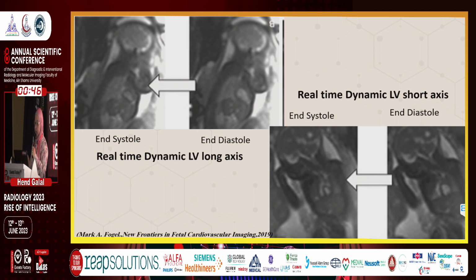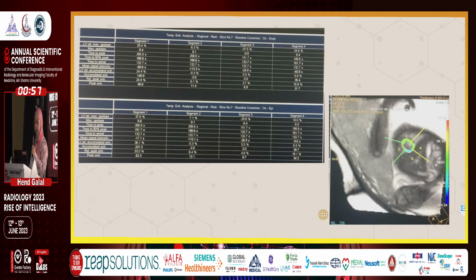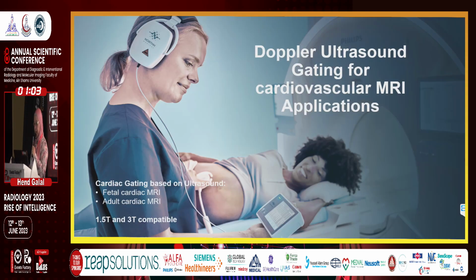But now we are focusing on just the anatomical assessment, and to see in long axis and short axis the differences of ventricular size between end systole and end diastole, and how the numerical functional assessment could be obtained.